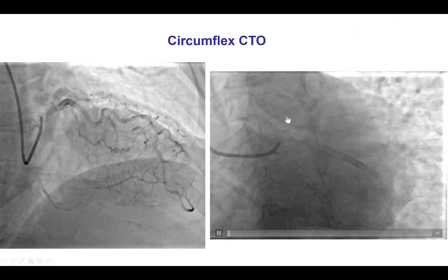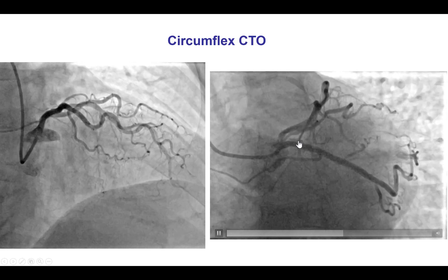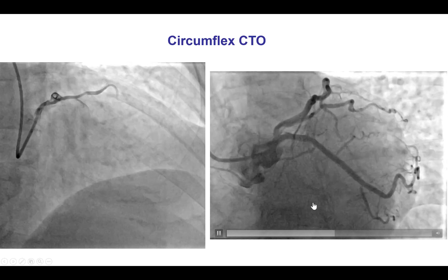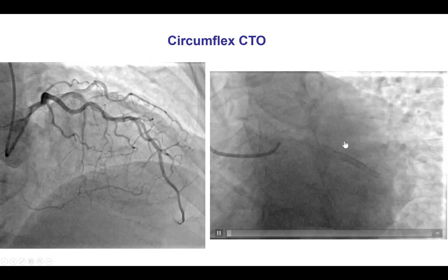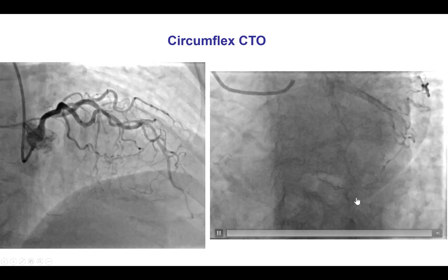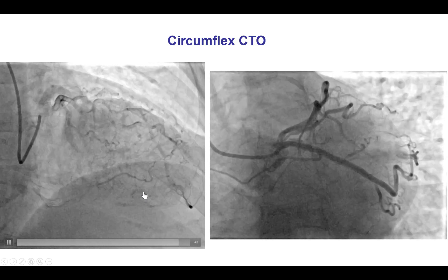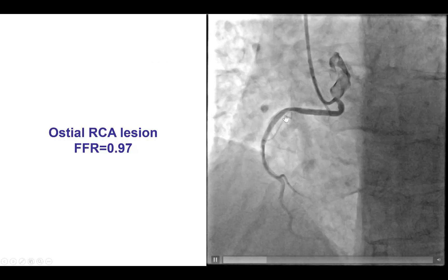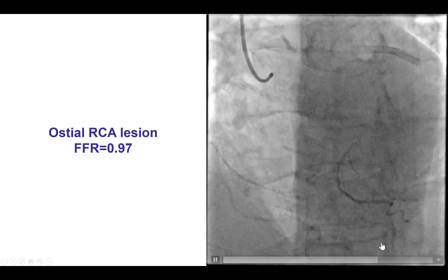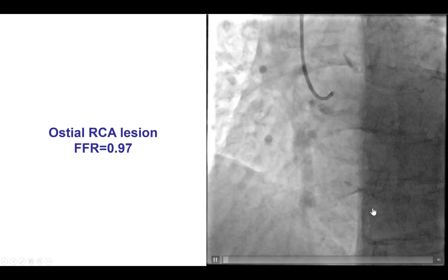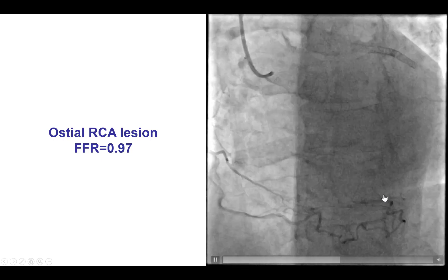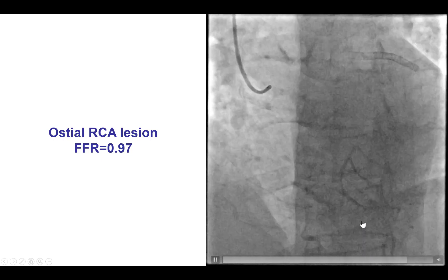She had multiple previous PCIs in the circumflex, with stents going from the proximal circumflex into a large obtuse marginal branch. This was a left-dominant system with a distal circumflex CTO with an unclear proximal cap somewhere within the previously placed stent, with the distal vessel filling via epicardial collaterals from the first obtuse marginal branch. There was also some disease in the non-dominant right coronary artery, with the marginal branch supplying a fairly tortuous epicardial collateral into the distal circumflex and the left posterior descending artery.